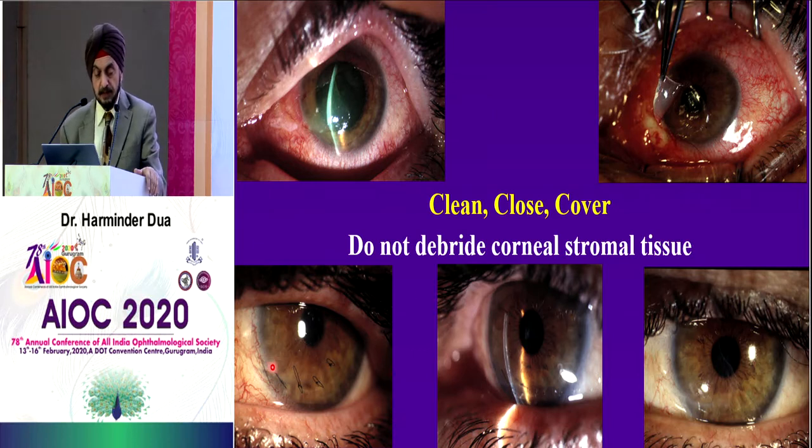You have to give tacking sutures. Now, these tacking sutures have no rules. You can just put them anywhere. They're very superficial sutures. But the important thing is that you have to align the extremity of the wound first. If that falls into place at the limbus, then the rest will fall into place, and it will have to be kept like you can see over here. And then when all the sutures are removed, there is just a very faint line of the scar, but the rest has fallen into place.